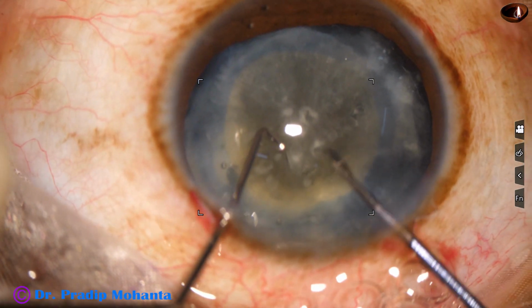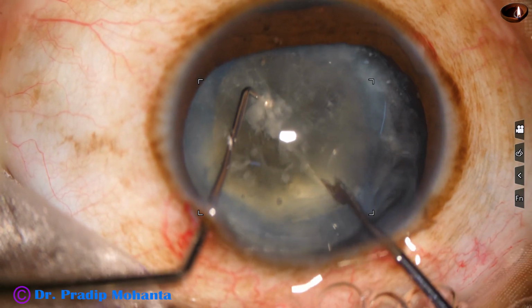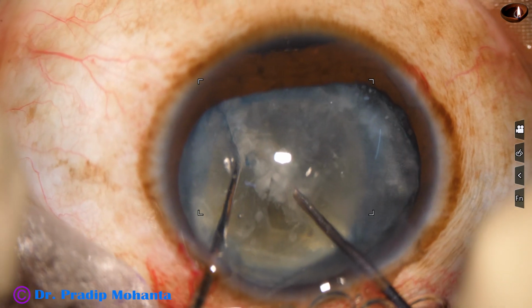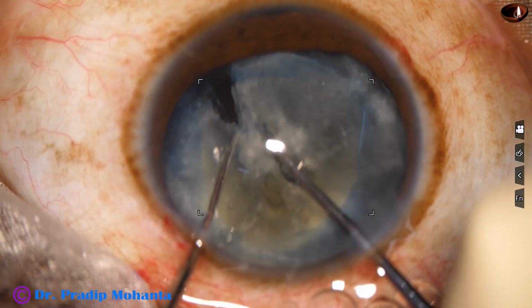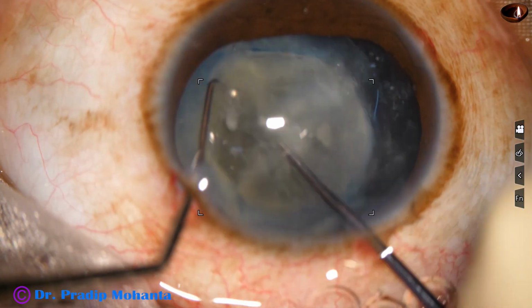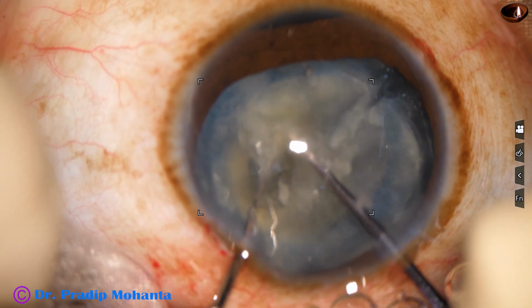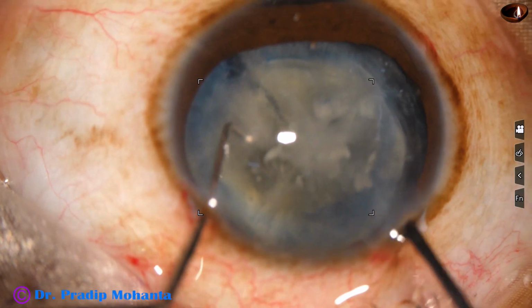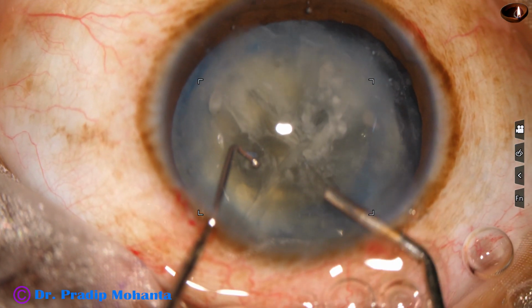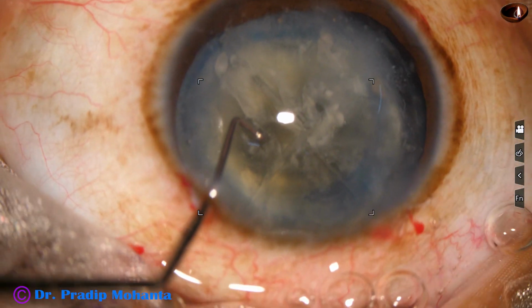So I plan to take this pre-chopper, and without rotation I plan to divide the nucleus into two halves. As I do this, I find that with two instruments I can rotate the nuclear mass easily. I could not divide the heminucleus which is at 12 o'clock, but the heminucleus at 6 o'clock could be divided into two parts. We have got three free fragments, one heminucleus and two fragments from one heminucleus.